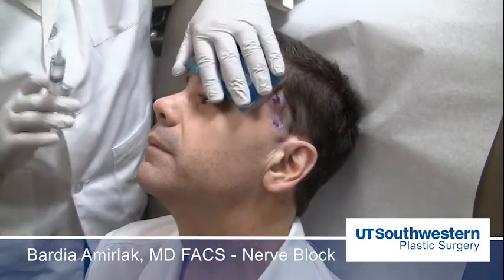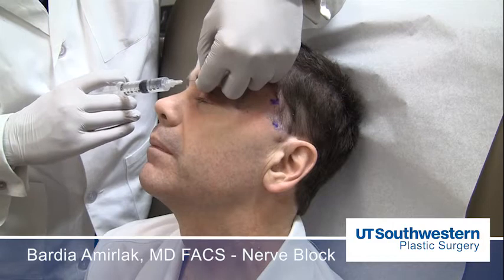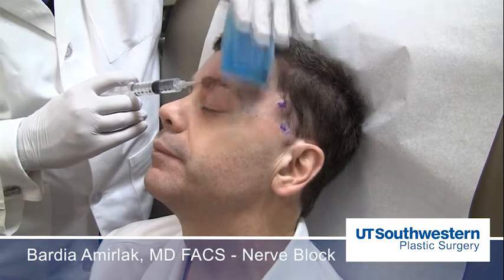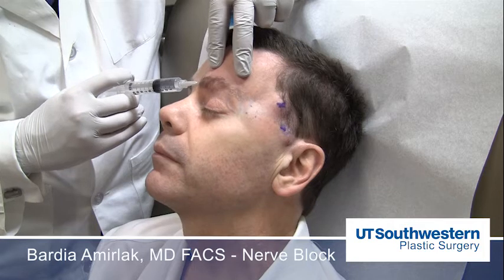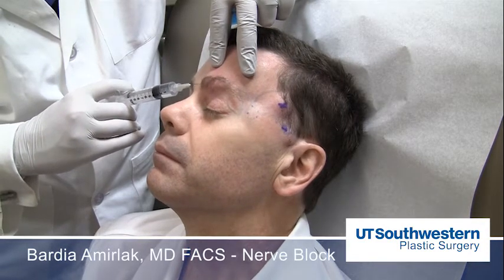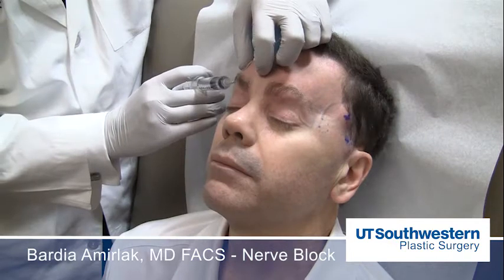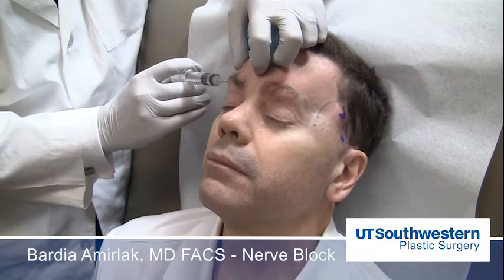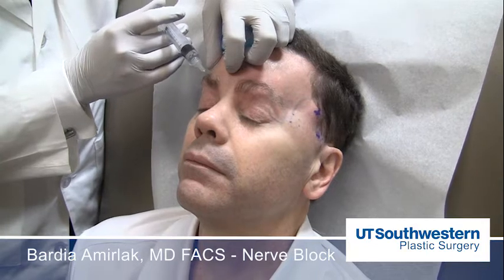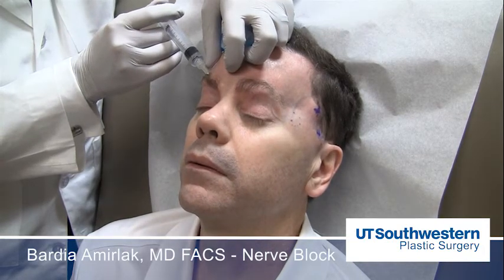For the supraorbital and supratrochlear, I first address them by pinching the brow in the deep subcutaneous tissue. You do a slow injection, especially when patients have tenderness. I do a fairly large volume — approximately 3 to 4 cc's — when I start injecting the eyebrow. Again, deep subcutaneous injection. I do the injection on this side and let it sit for a couple of minutes. You want to extend this medially to catch the supratrochlear nerve complexes.